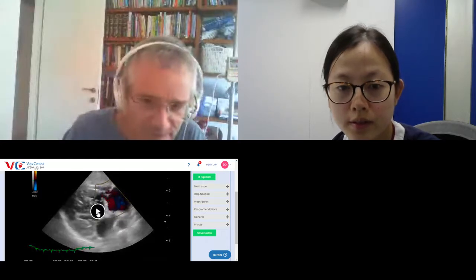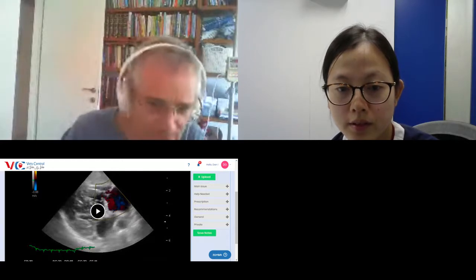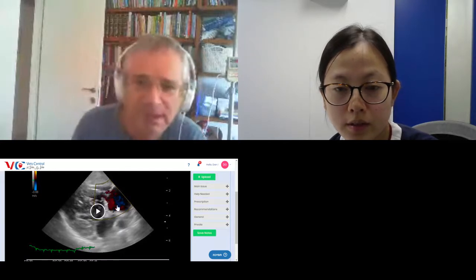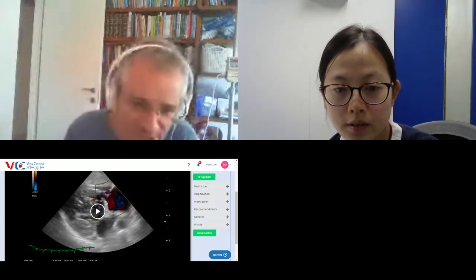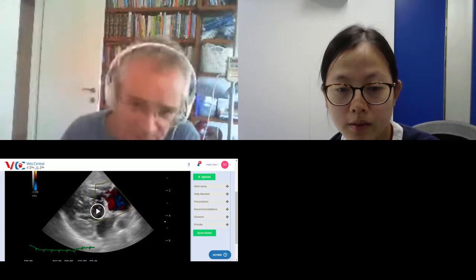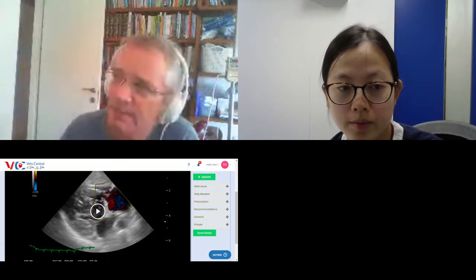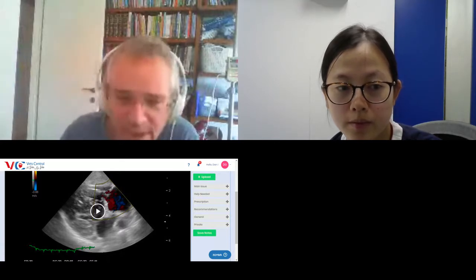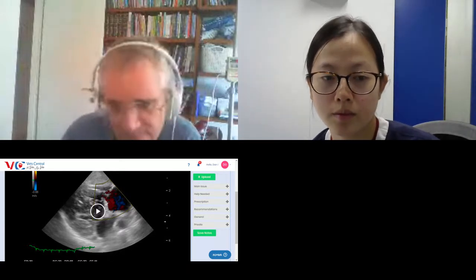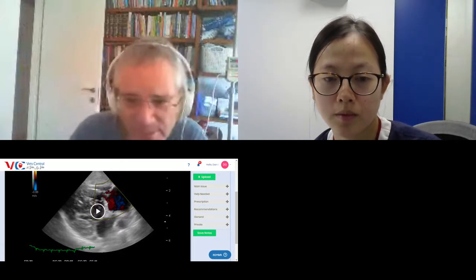Okay. So if we did that from a different angle, but if I'm correct with this assumption, this means that this peak flow velocity is really high, and when it's measured in meters per second, it is translated into a peak systolic pressure gradient between the right ventricle and the right atrium, which is about 3 times above normal. Normal should be 25, maybe 30 at worst, and in this case it was 73. So it's about 3 times above what it should be.